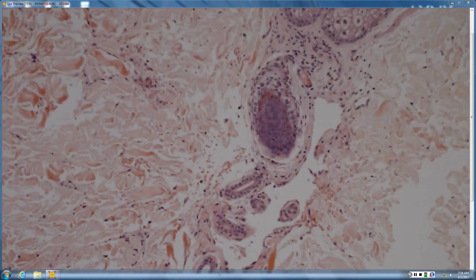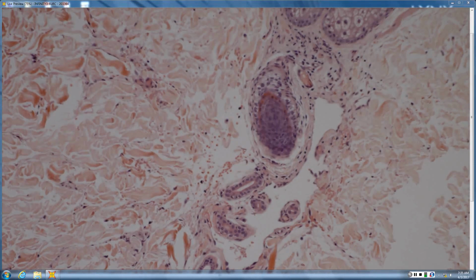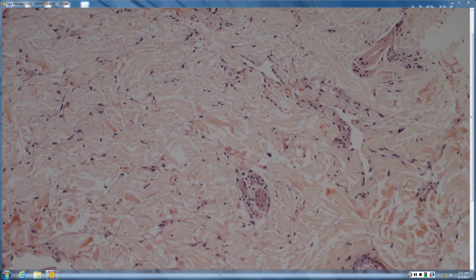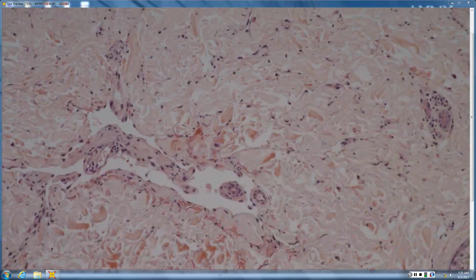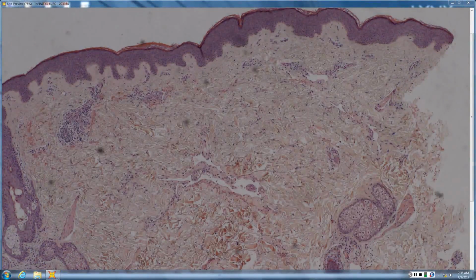And in fact, here again, you have promontory signs with pre-existing vessels and ducts jutting out or appearing to float within an irregular, jagged structure. Same thing up here, little vessel there. But this is HHV8 negative. And it is on a young person's extremity, and it's a little bump, and then there's kind of a brown halo around it. So it's like a targetoid. So targetoid hemosiderotic or hobnailed hemangioma.